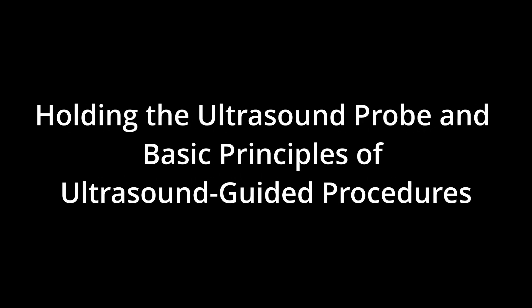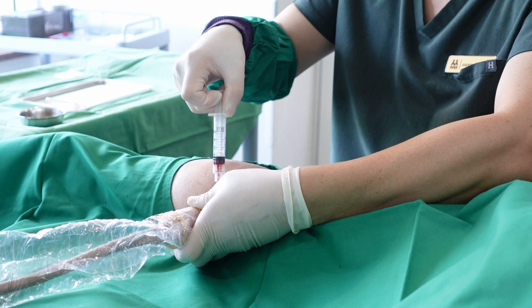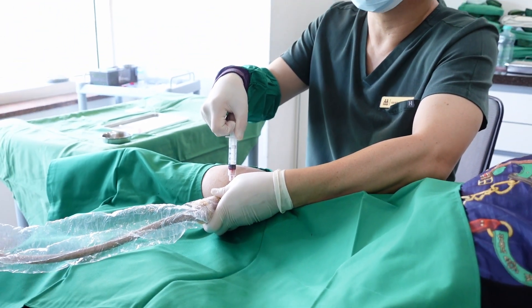In this presentation, we will discuss the proper way to hold the ultrasound probe during scanning and explore the fundamental principles of ultrasound-guided procedures.